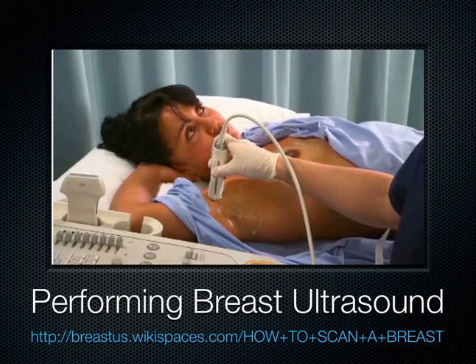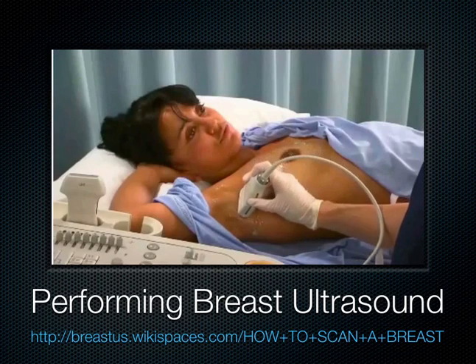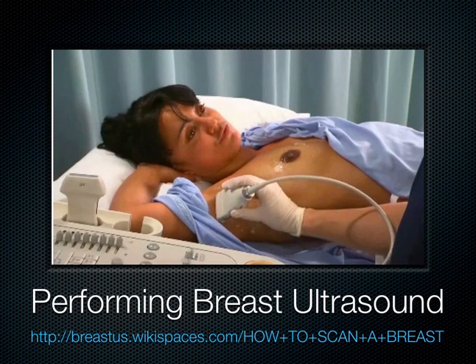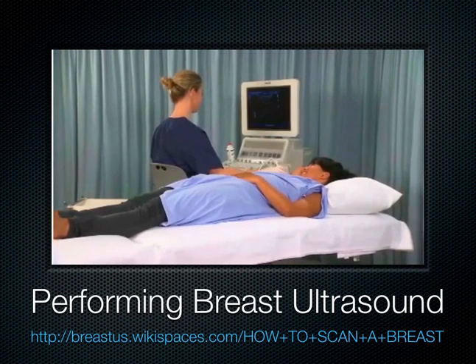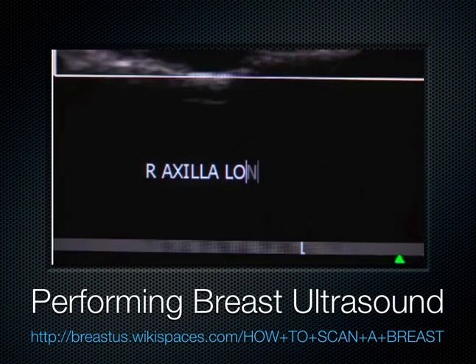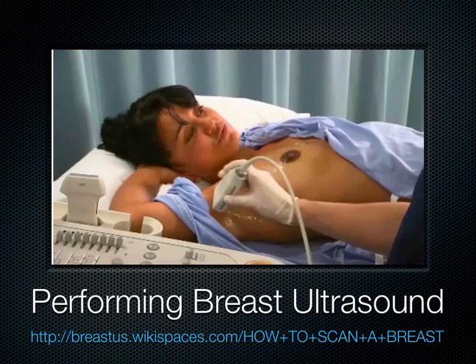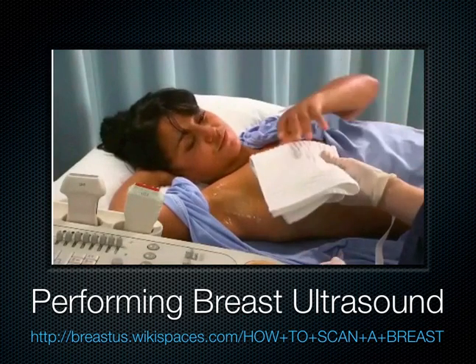Place the transducer in the superomedial aspect of the axilla in a transverse position. Slide inferiorly, then laterally, and finally superiorly until the whole axilla has been examined. Return the transducer to the midline in the longitudinal plane. Optimize the image, then freeze, annotate, and save the image. Repeat the process in the transverse. Give the patient a towel or cloth to wipe off the gel.